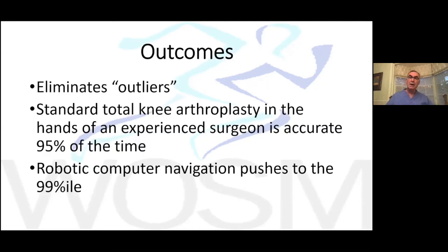So, brings me to my next and final major point, which is outcomes. The goal is to eliminate outliers, whether that's because of deformity or soft tissue contracture.